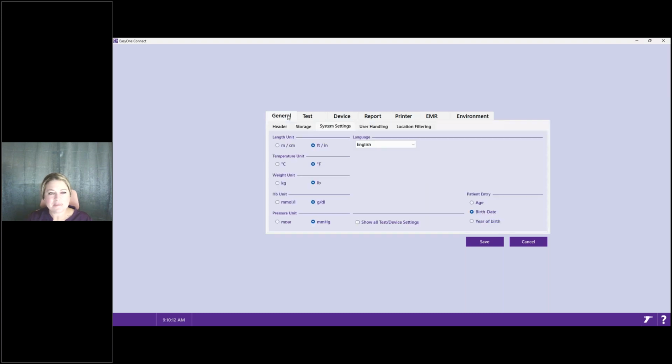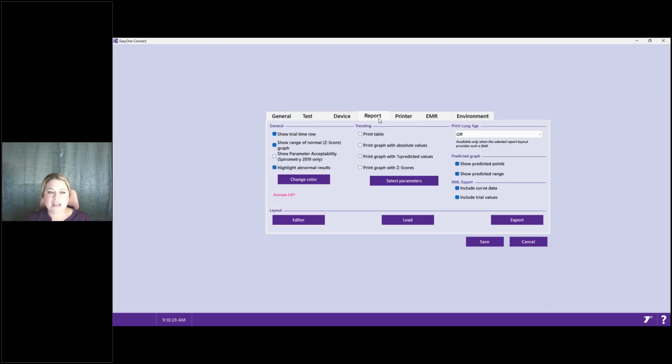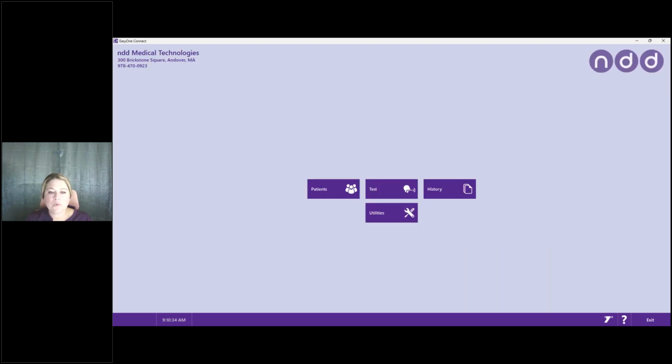All right. Again, a very quick overview of the settings, but I always like just to point out where some of these most commonly asked about settings are, just so that you guys feel comfortable getting these devices set up and customized for your use. All right, so now that all the adjustments that I would like to make have been made, I can come back here and I can click save. All of my settings will be retained and it'll bring me back out to the main menu.